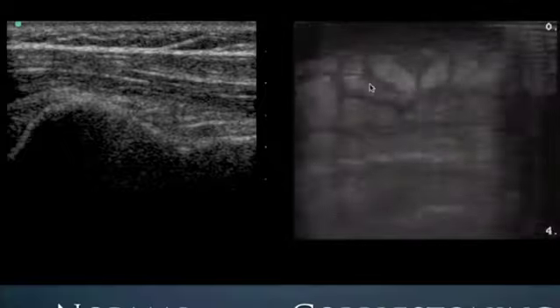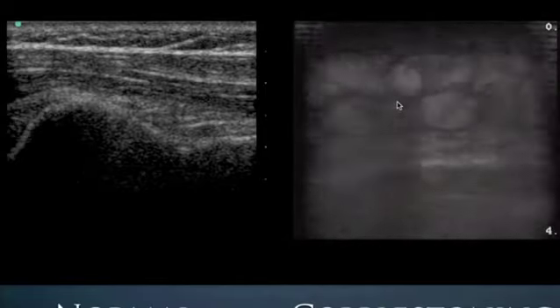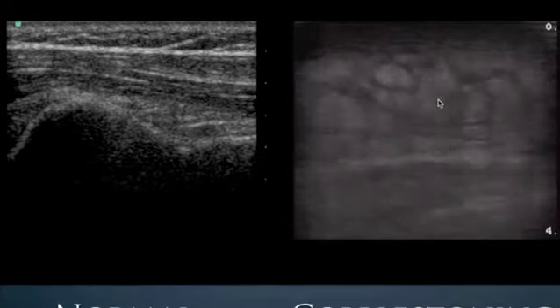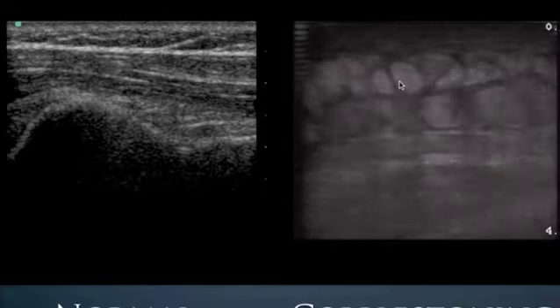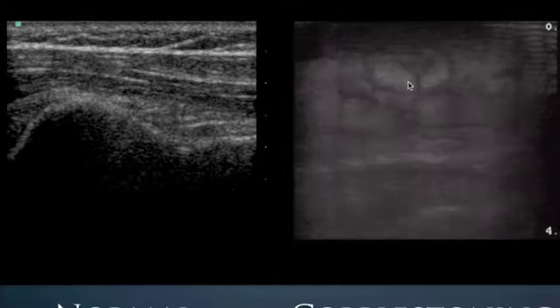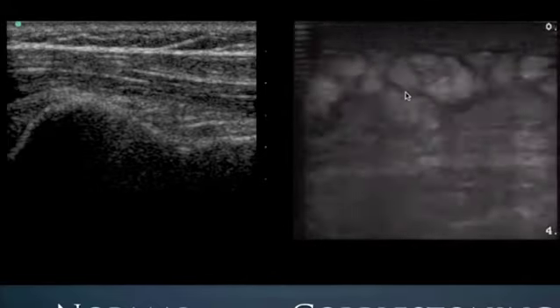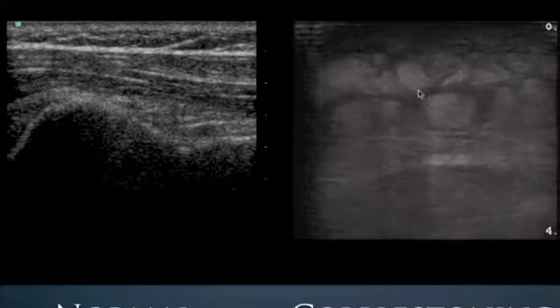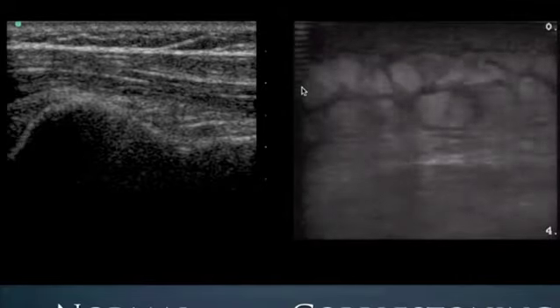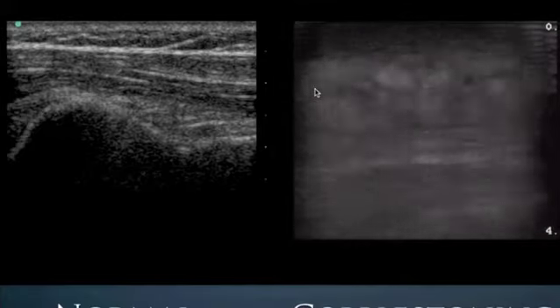Here's this patient's arm in question. We can see prominent cobblestoning going on there, and this is consistent with cellulitis and not abscess. Notice the hyperechoic areas of inflamed soft tissue seen here with hypo or even anechoic areas between them. These islands of hyperechoic areas are referred to as cobblestoning of cellulitis. Sometimes this is also seen in patients who simply have edema, but there's no abscess demonstrated here.